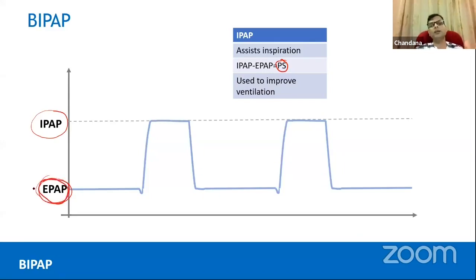That is what actually recruits more and more alveoli. That is what actually increases the functional capacity, or increases the lung volume, and recruits the alveoli, and that increases the oxygenation of the patient. That will improve the saturation of the patient.